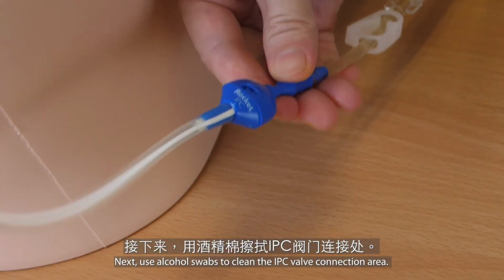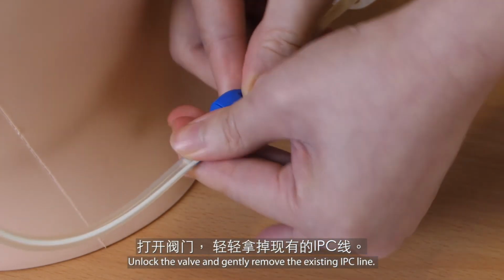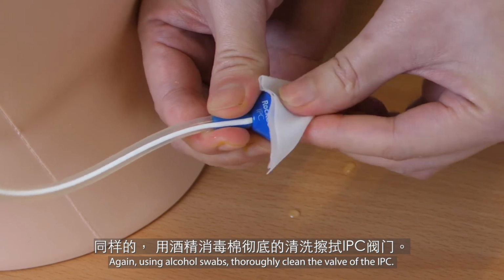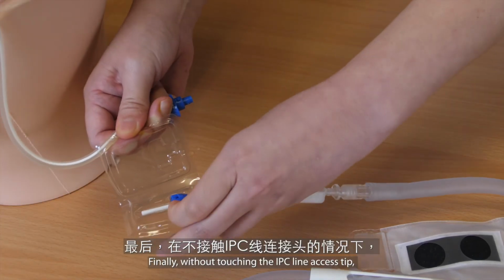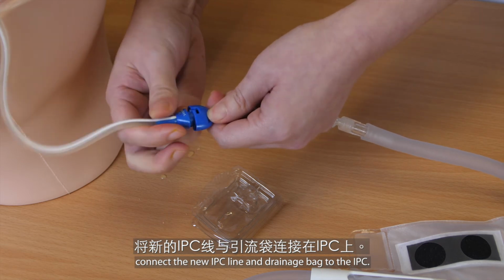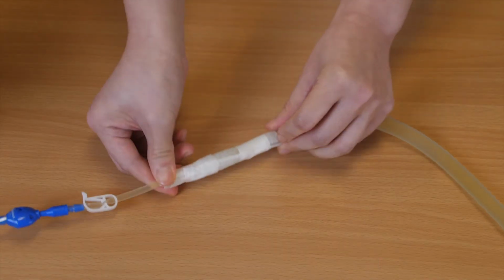Next, use alcohol swabs to clean the IPC valve connection area. Unlock the valve and gently remove the existing IPC line. Again, using alcohol swabs, thoroughly clean the valve of the IPC. Finally, without touching the IPC line access tip, connect the new IPC line and drainage bag to the IPC. A click should be heard. Surgical tapes can be used to secure the connection site.